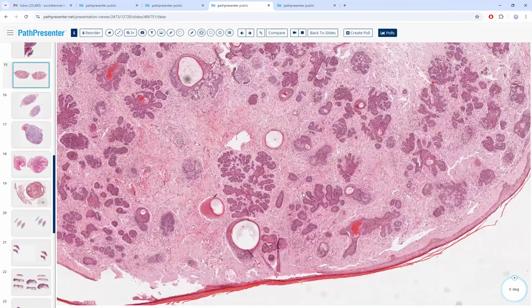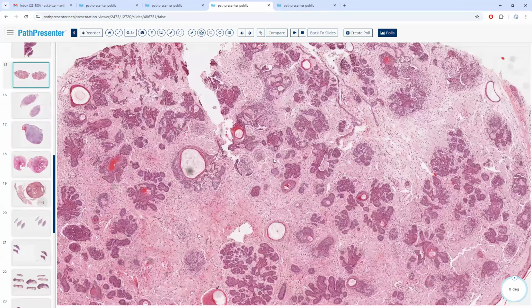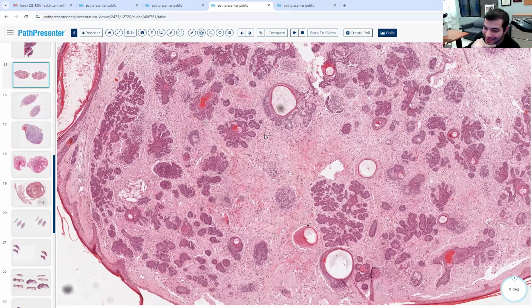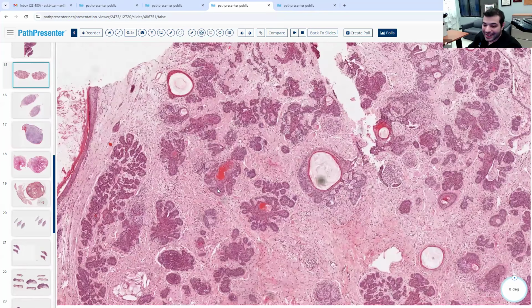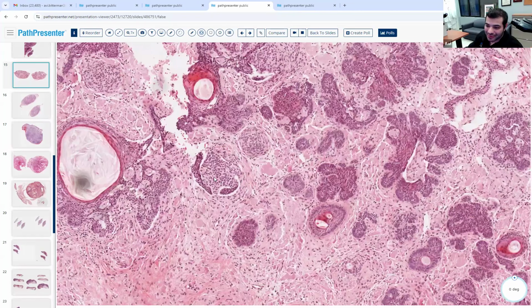Is it a trichoepithelioma? Good. And why is it a trichoepithelioma? It looks like the classic one. You have the cyst, but you also have those lobules. And so it's keratinizing, so better for trichoepithelioma than trichoblastoma. Yes, it looks like a follicular neoplasm. It has a fibrous stroma. And you notice this retraction, but really this is what?